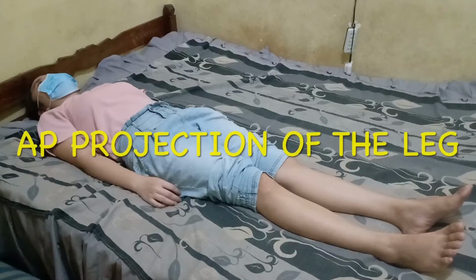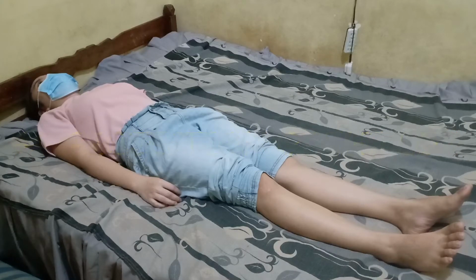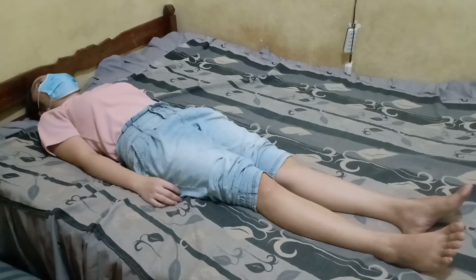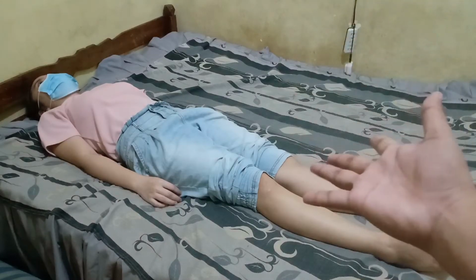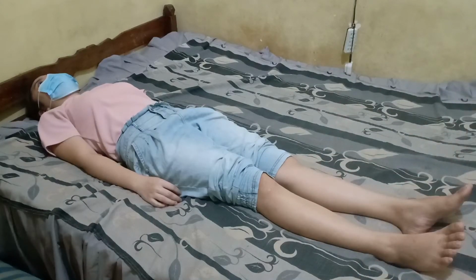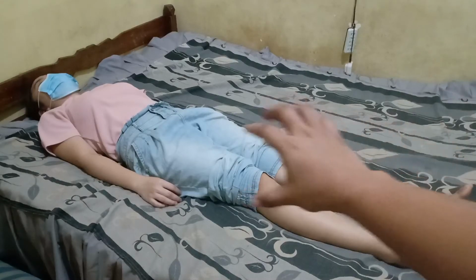The first radiographic examination that I am going to demonstrate is the AP projection of the leg. For its part 1, now I am going to show you the part and positioning details of the patient body. So for its patient position, place the patient in the supine position, which you can see here that the patient is already lying in a supine position. Then after that, provide a pillow for the patient's head. Next, the patient's leg should be fully extended.